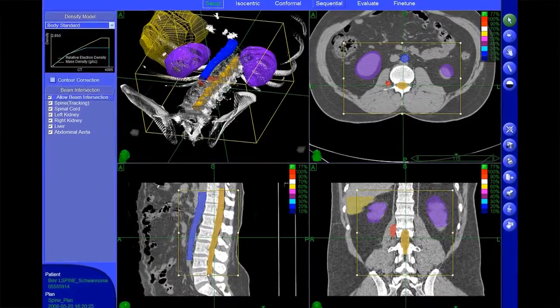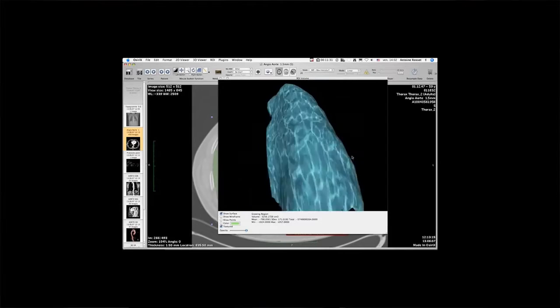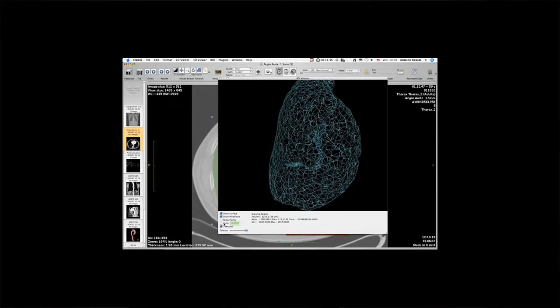An MRI, it stands for magnetic resonance imaging. It also gives you this 3D volumetric model of you, but it's based entirely differently than X-rays, like the CT scan. It's based on magnetization, and so you get a very, very high, powerful magnetic field. It orients all of your protons in one direction, along with the magnetic field, which is not dangerous, I might add. Okay, completely harmless. And then what happens is a little pulse knocks them out of their alignment, and then they come back in slowly.